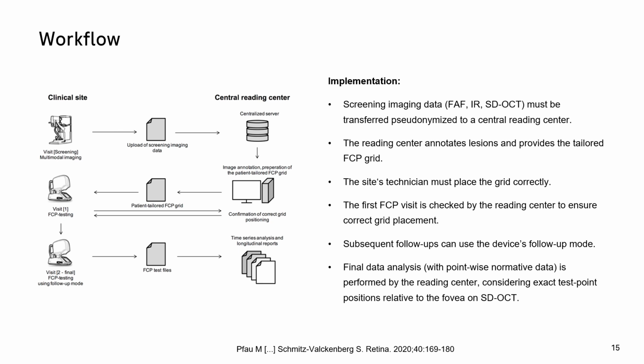Here you can see the workflow, how it is nowadays implemented in clinical trials. So basically you have a screening visit where imaging data is taken, then the reading center annotates this baseline imaging data and creates a patient-tailored grid. That grid is sent back to the site, runs the grid, the reading center confirms that the grid position is correct, and subsequently just the follow-up mode of the device can be used.